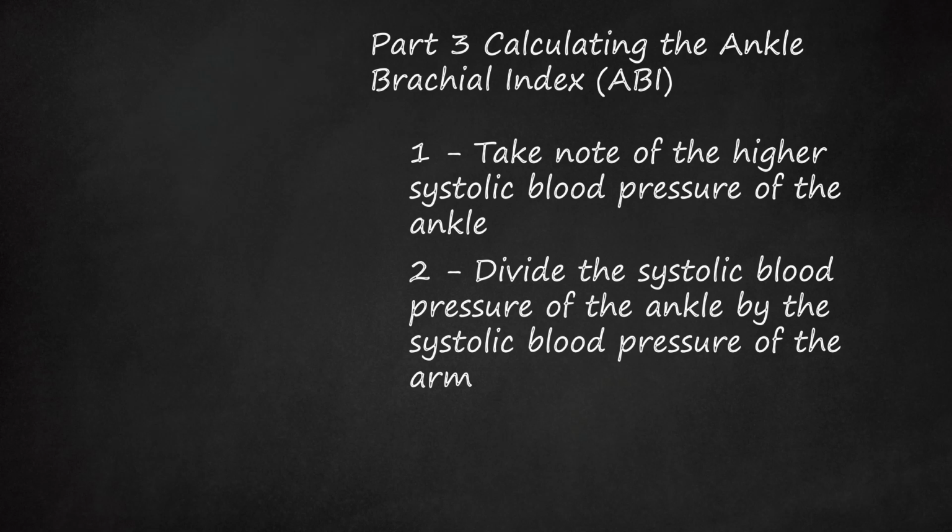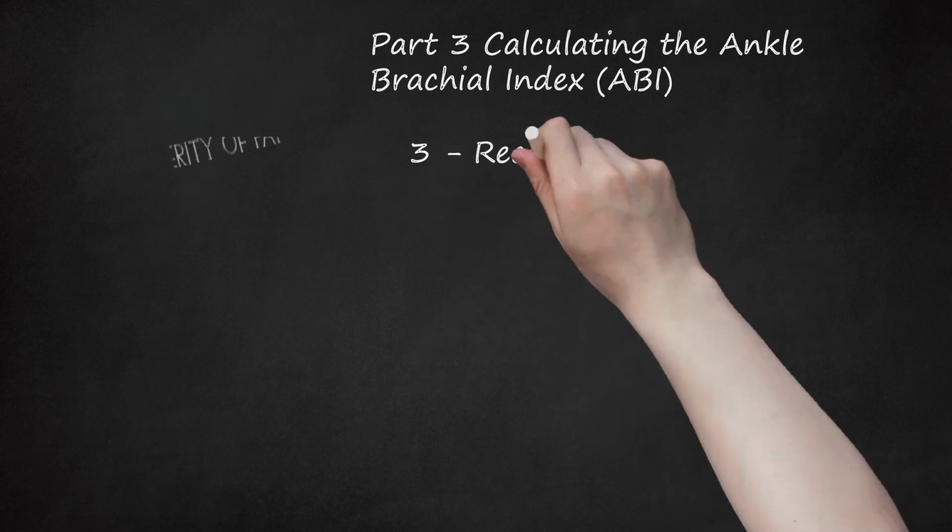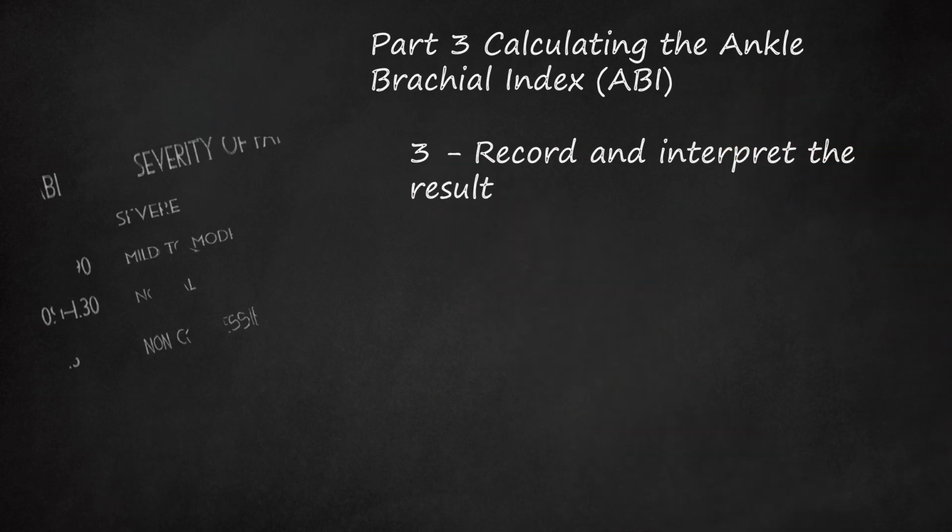Example: the systolic blood pressure of the left ankle is 120 and the systolic blood pressure of the arm is 100. 120 divided by 100 equals 1.20. 3. Record and interpret the result.